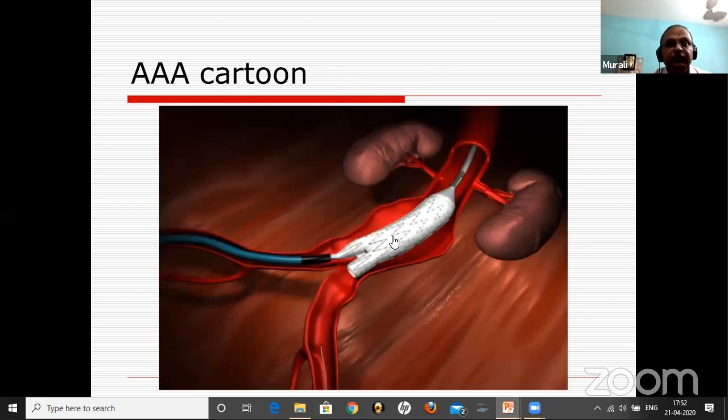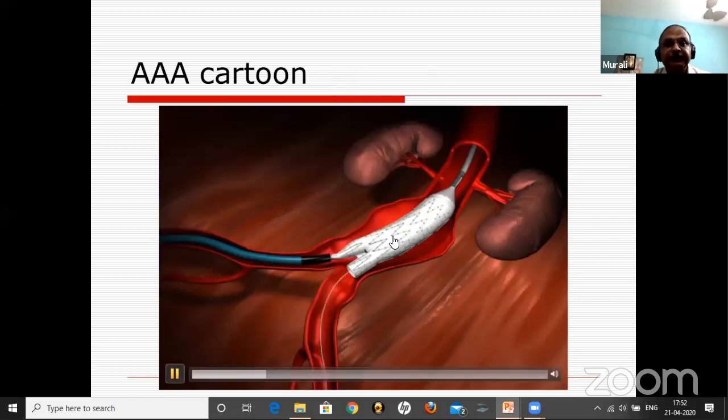So the next thing is, you see the opposite gate and then cannulate it. So that is what is being done. So once it is cannulated, they open the top gate here. Then you take the next device. So at this position, what you do is, you want to place the next graft. You have to do it above the internal iliac artery. So again, the next graft also has to be, the length has to be decided. Suppose if there is a junction zone here, from here to here, how much of overlap you want and how much of graft you want, up to the internal iliac artery you have to see. And then you have to deploy. You can always put in a marker pigtail and measure the distance again from here to here, and then you can deploy the second graft.